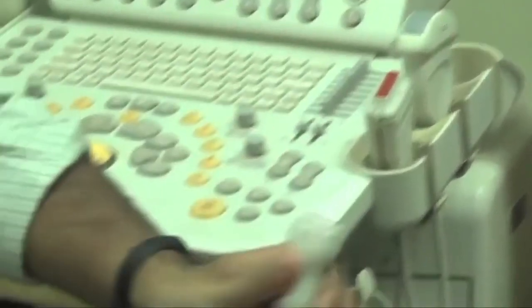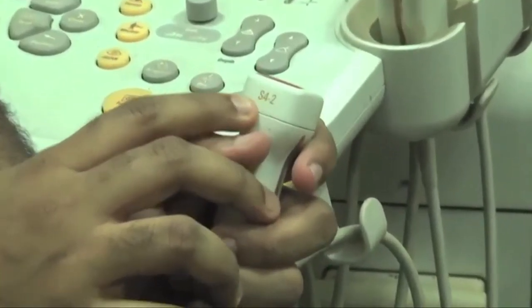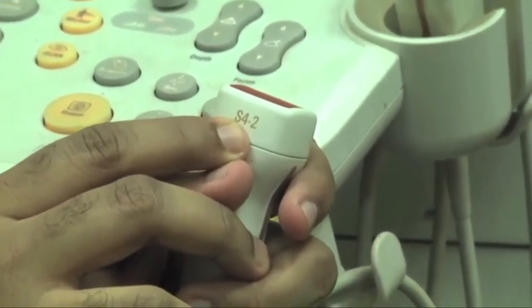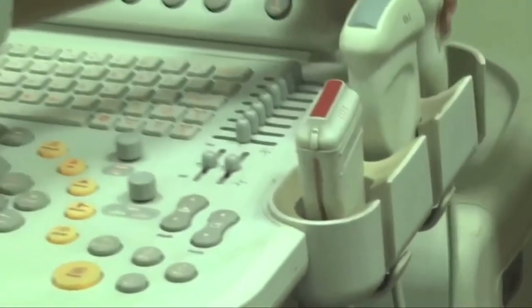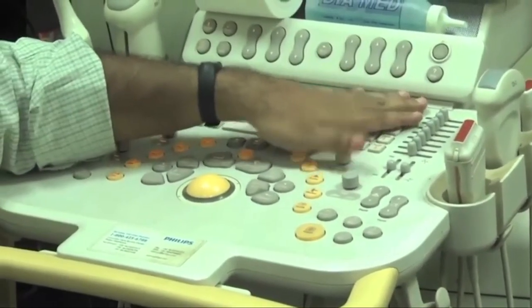The other probe which we had seen was a sectoral probe for cardiac imaging. So this was an S42, a sectoral probe at 4 megahertz, and the second generation of that particular probe. Now, there are some other controls which you can see up on this control panel.